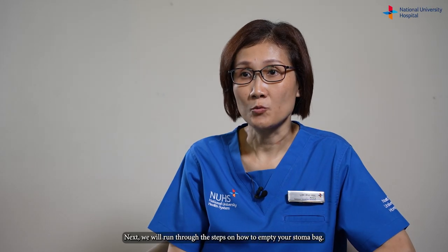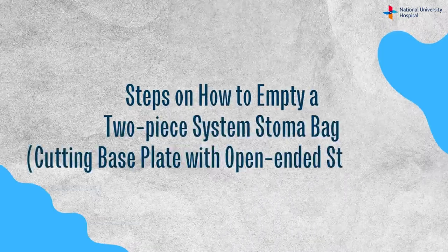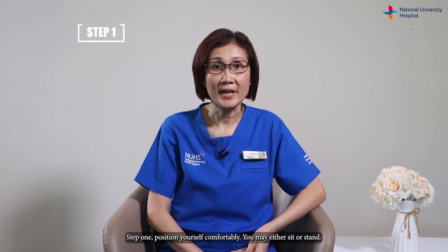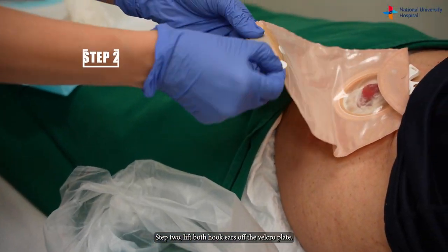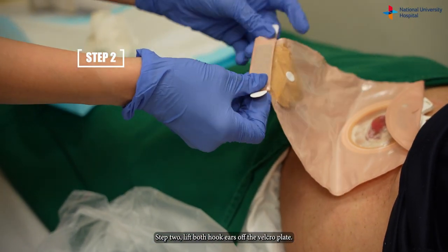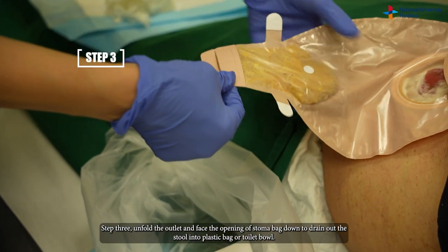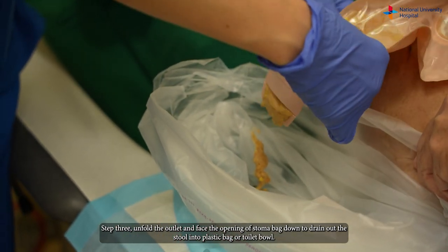Next, we will run through the steps on how to empty your stoma bag. Step one: position yourself comfortably — you may either sit or stand. Step two: lift both hook ears off the velcro plate. Step three: unfold the outlet and face the opening of the stoma bag down to drain out the stools into a plastic bag or toilet bowl.